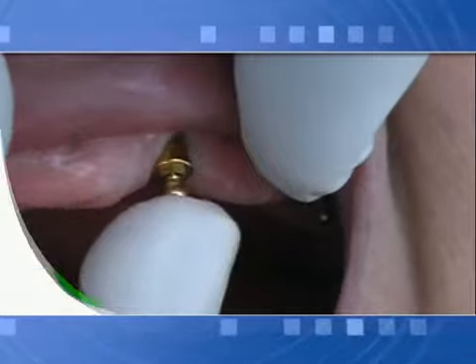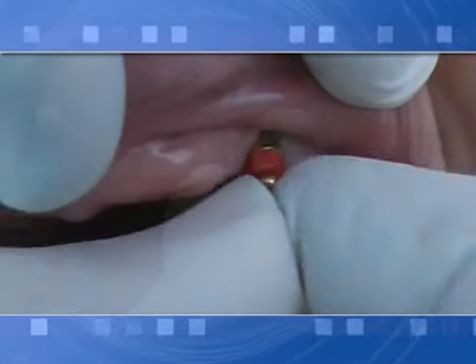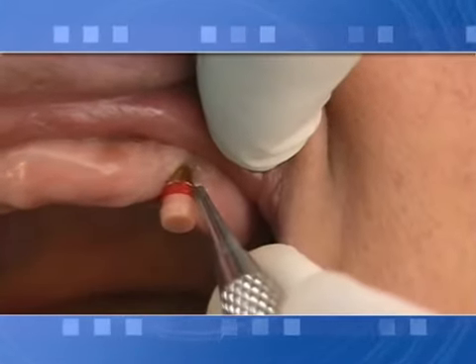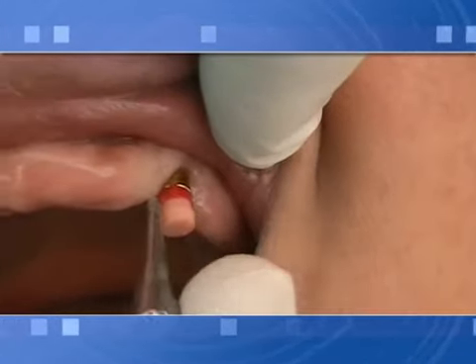Set the directional ring over the sphere, finding the right connection side to the hexagon. Insert the retentive cap and rotate the ring using a pointed tool until the parallel position is set among all caps.